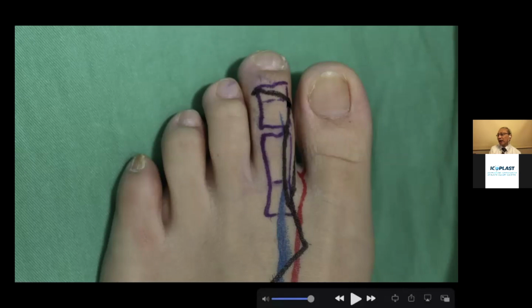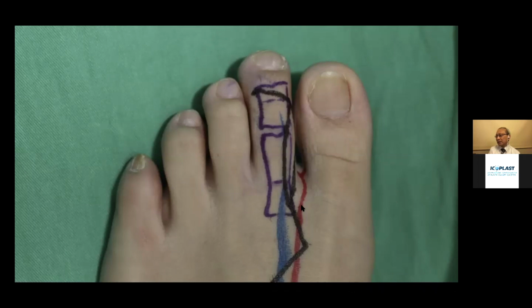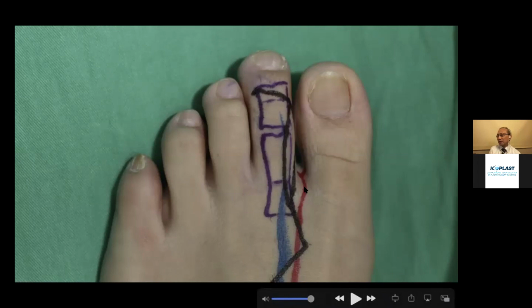The incision will be crossing over the toe, which helps us do a circumferential degloving of the toe PIP. Then we can do the resection of the joint and harvest the toe joint for the transfer. And of course, we can extend our dissection. Usually I will use the superficial venous system of the foot for the drainage vein, and use the metatarsal artery, no matter whether it's a dorsal system or plantar system. Basically, I try to use larger vessels for the anastomosis to make the microsurgery safe. We can sleep better at night.